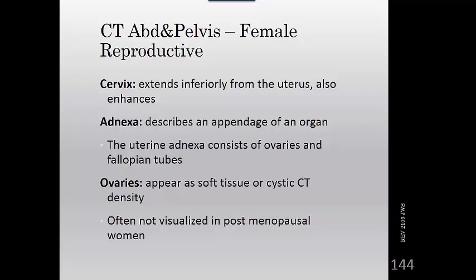What you look for are inflamed ovaries or ovarian cysts that are causing pain in females, and ruptured ovarian cysts as well. There may be free fluid floating around if one of those cysts has ruptured. You'll see that as well.